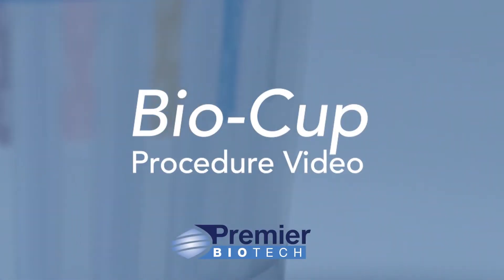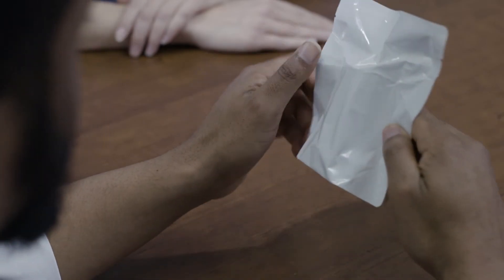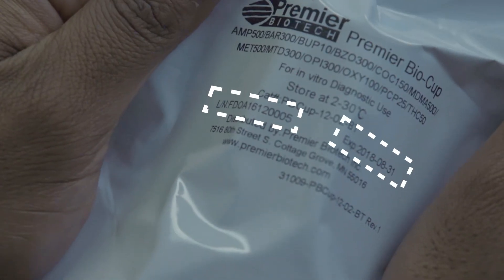Premiere BioCup procedure video. Carefully inspect the foil pouch to ensure there are no tears, cuts, or damage to the packaging. Check the lot number and expiration date.